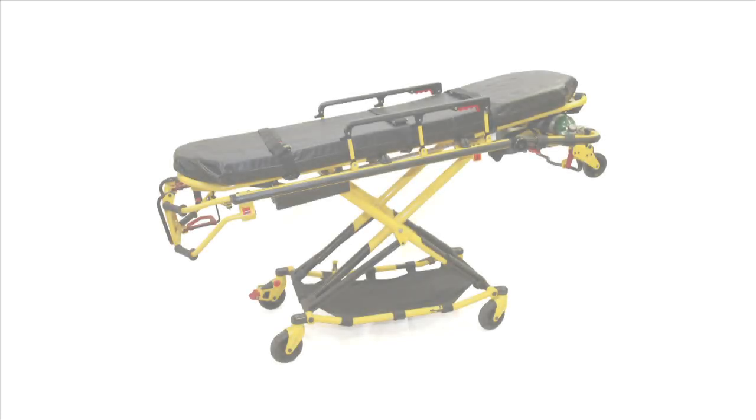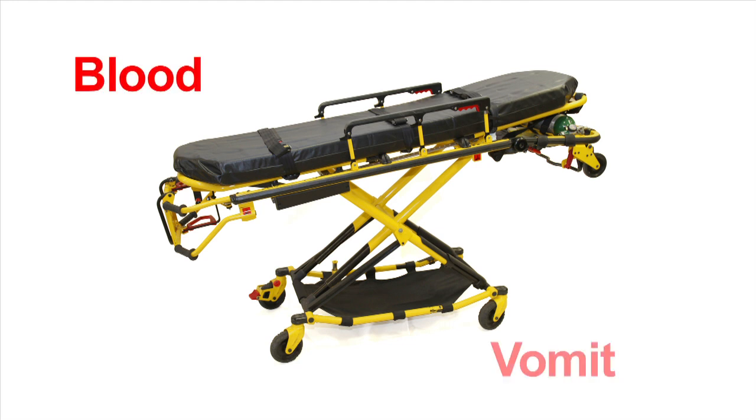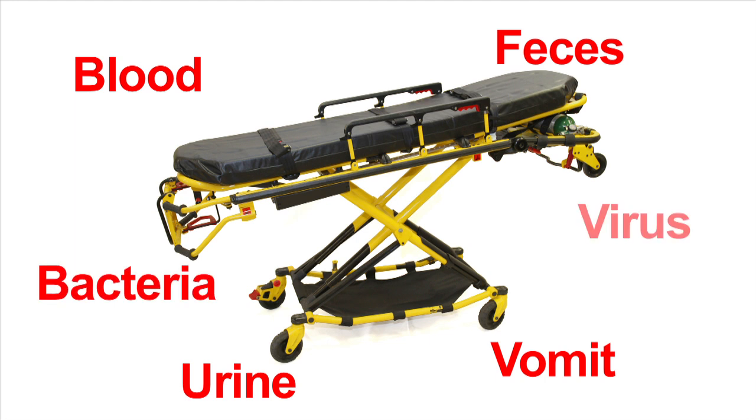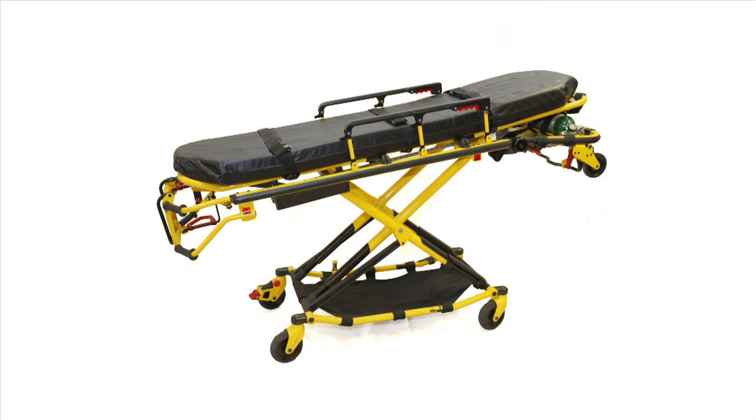Every patient we transport in an ambulance is placed on an ambulance gurney mattress. These mattresses are considered high-touch surfaces. Damage from daily use is the norm, and keeping up with mattress maintenance is difficult at best. Blood, vomit, urine, feces, bacteria, and viruses all come in contact with these mattresses, so keeping them clean is a must. Using PathoWrap can help keep your gurney mattresses clean and in service.